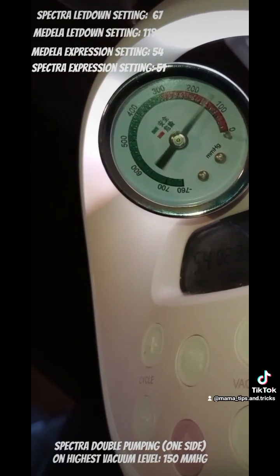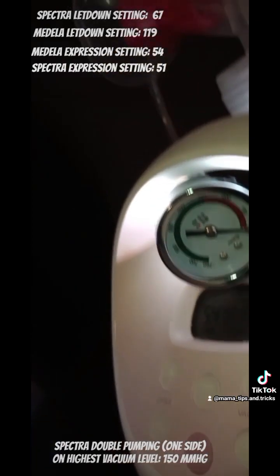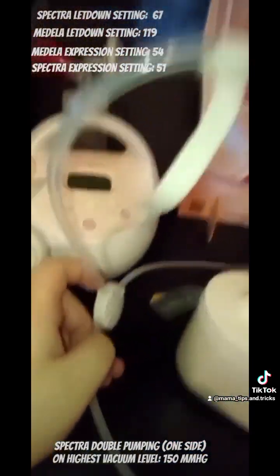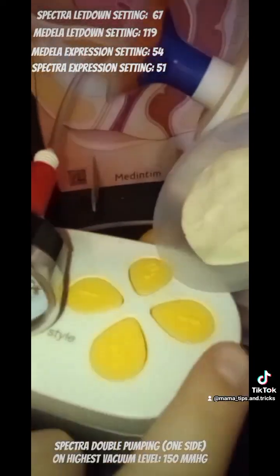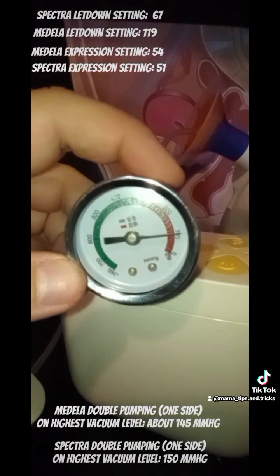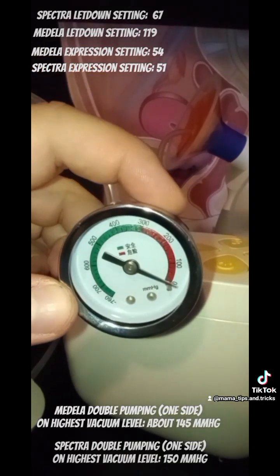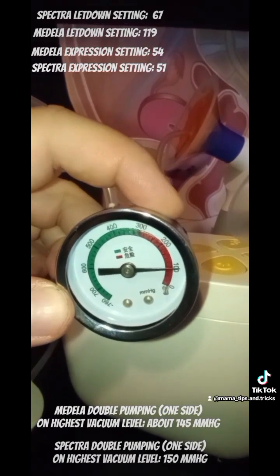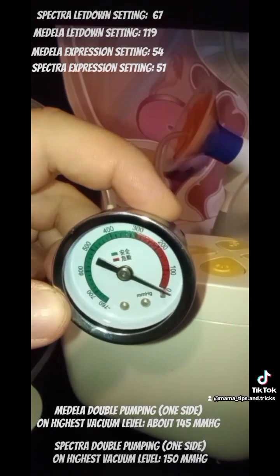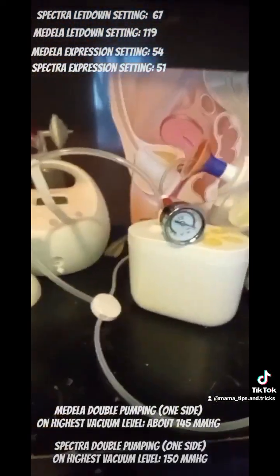So as you can see on the vacuum meter, Spectra is on the higher end between 140 and 160. So it's around 150, but it's on the higher end. So it's almost like, I'd say 155 actually. And then the Medela, when it's slowed down, is also between 140 and 160, and that is going to be on the lower end. So I'm calling it like 145 because it isn't 140, but it's lower. So it's in between 140 and 150. One thing to keep in mind is that with Medela, you cannot make it go any slower than this.